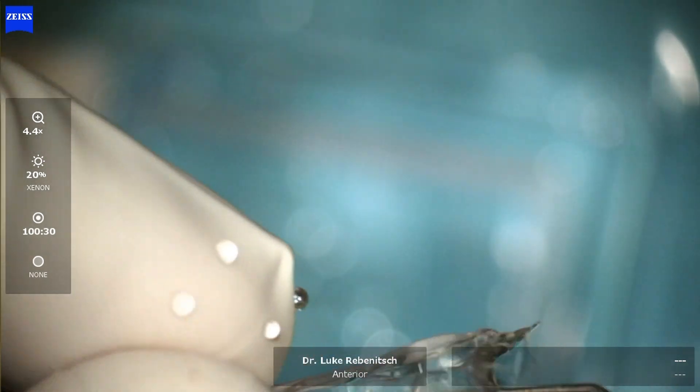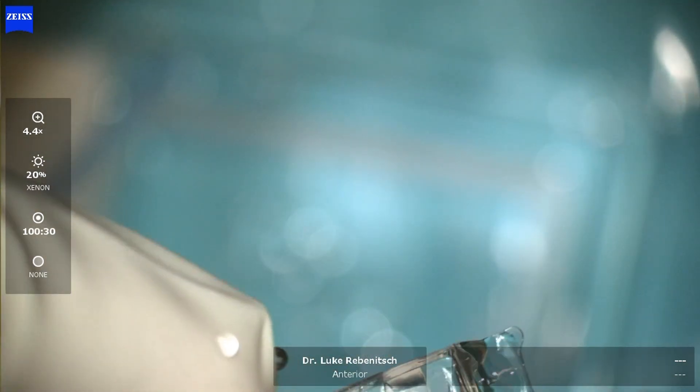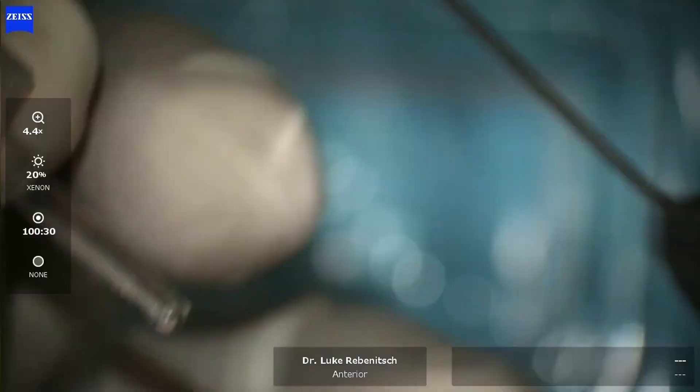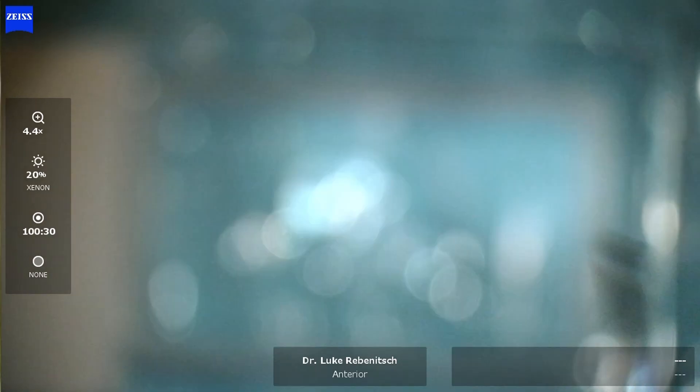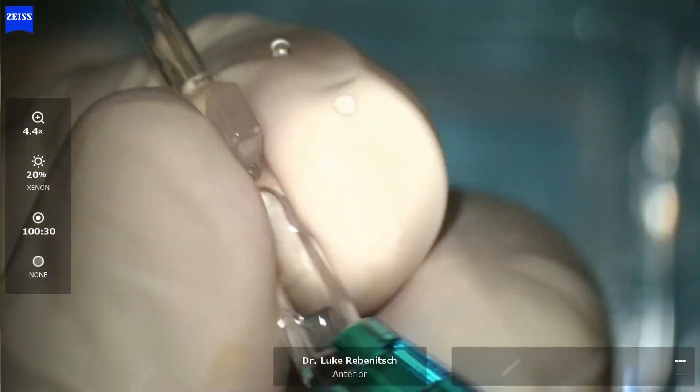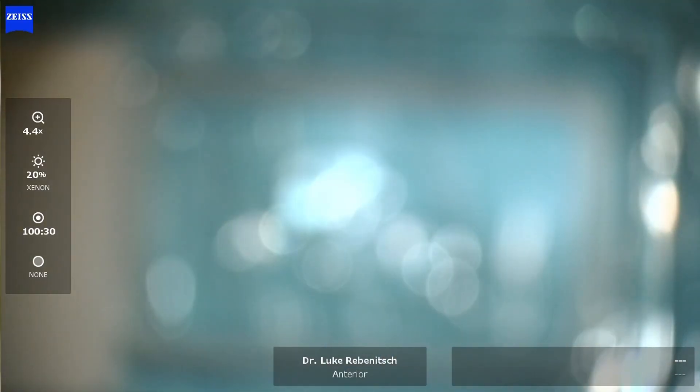Now the lens is placed onto the inserter and then folded and ultimately rolled. This allows us to place the Evo ICL through a small opening, diminishing trauma to the eye. We then roll the lens by pulling it through the inserter and fully assemble the inserter.